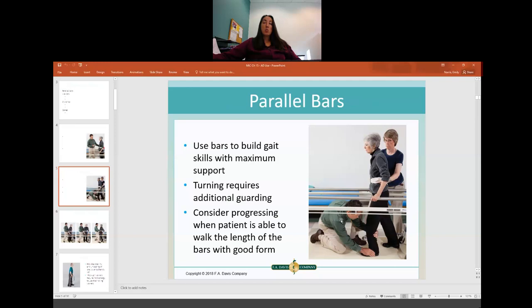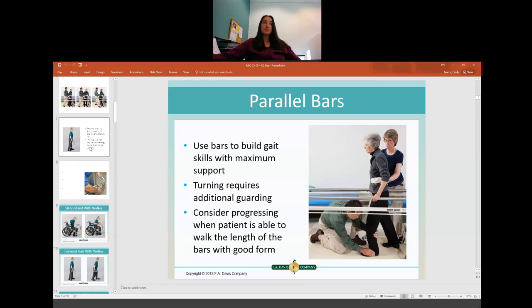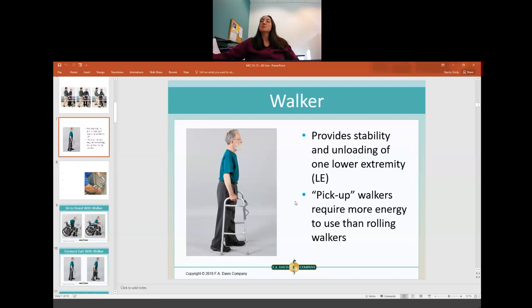Once the patient is able to walk the entire length of the parallel bars with good form, that's when you start thinking they can use an assistive device and walk outside the bars. The next assistive device we typically progress them to is a walker. A standard walker doesn't have any wheels and provides a lot of stability. It's called a pickup walker because you pick it up after every step. It requires a little more energy but is also more stable, so it may be a better choice for some patients.